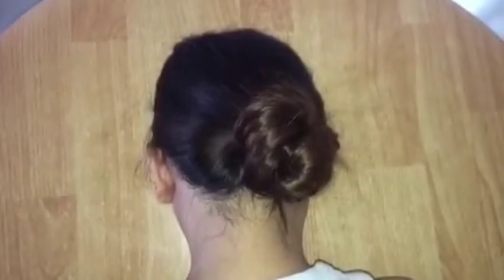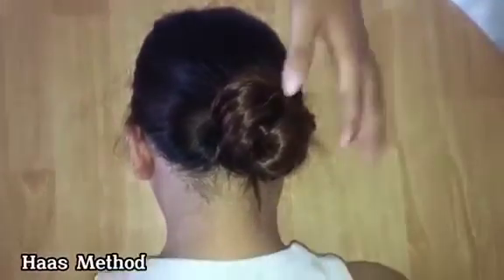So this is now the Haas method, which is the PA axial projection. So the patient is in prone position. The MSP and OML are perpendicular to the IR. Forehead and nose against the table. The IR is centered 1 inch to nasion.